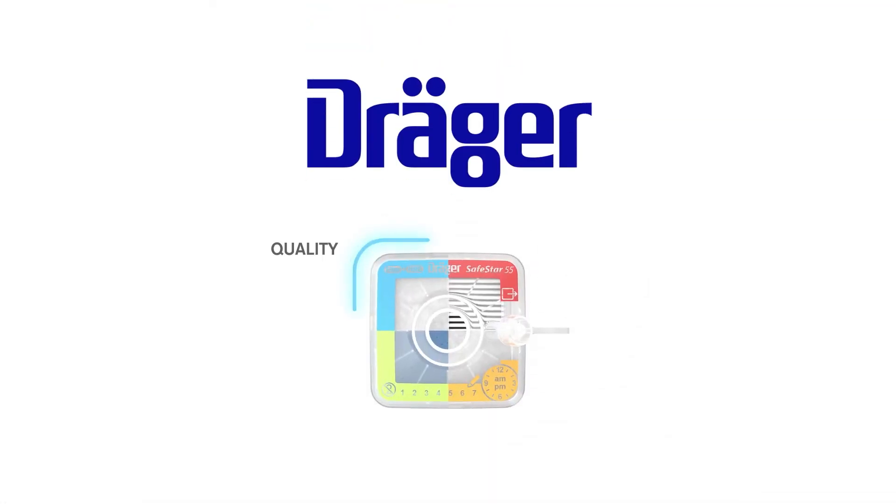Draeger filters. Quality at every corner. Because we understand.